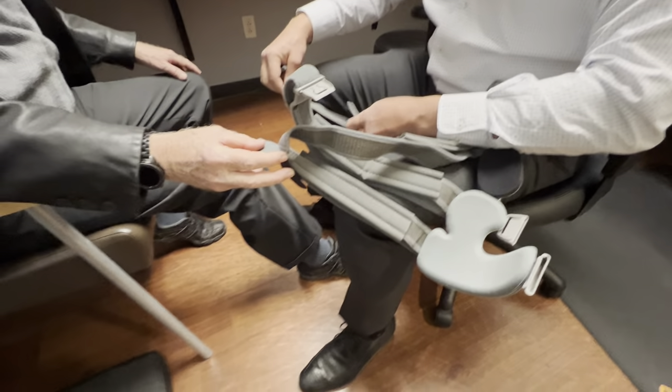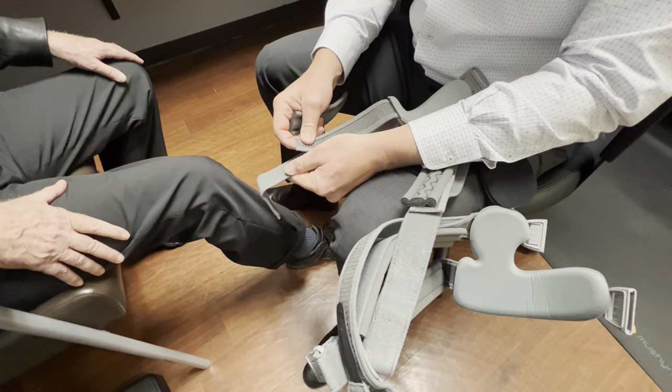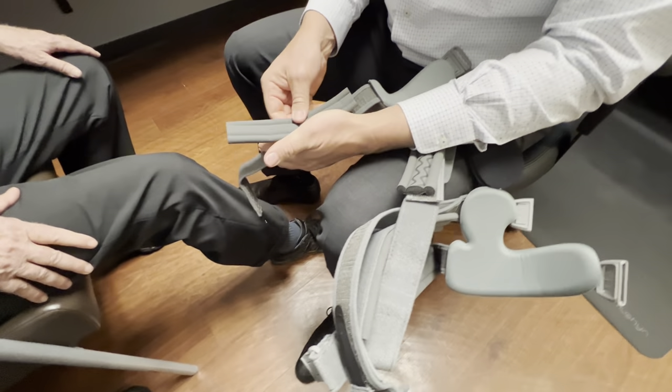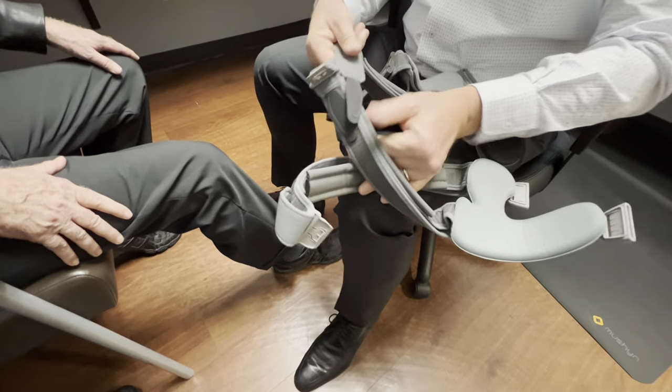What you'll have to do is adjust the length of the straps for the patient's leg first, and then for the patient. Once this is done the first time, they never have to readjust it.